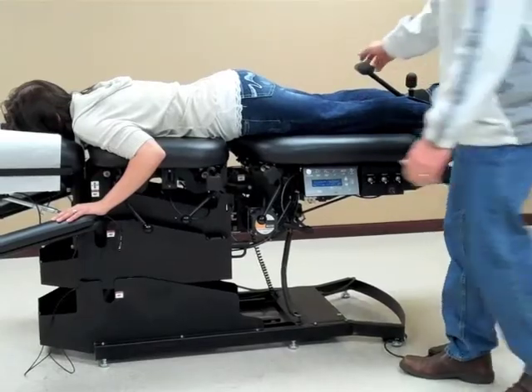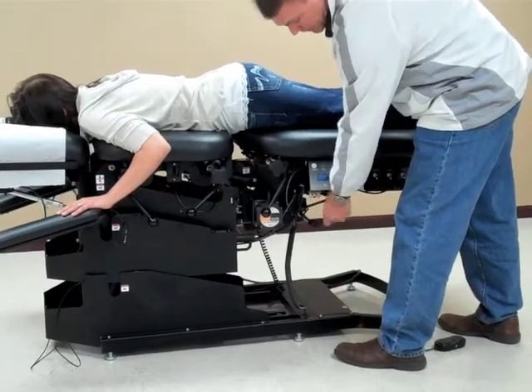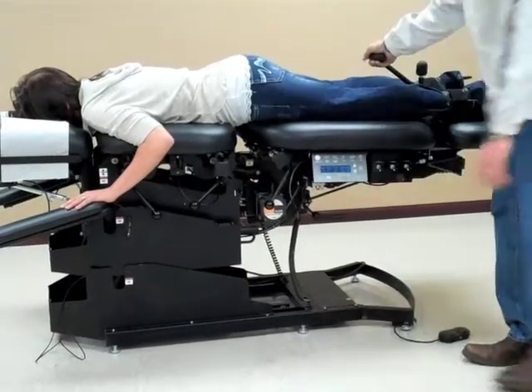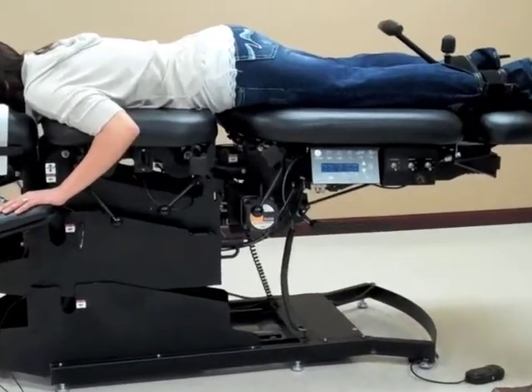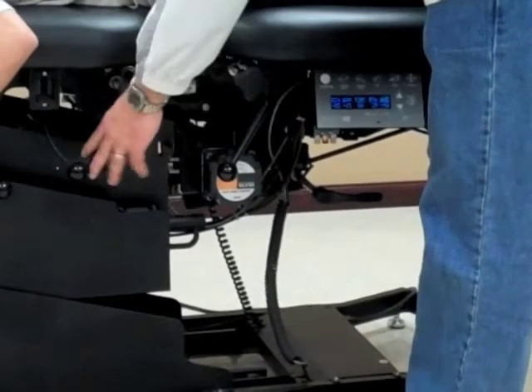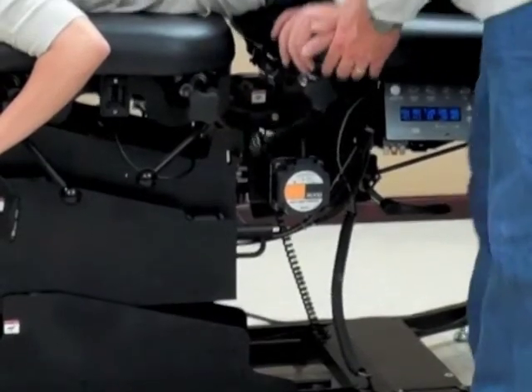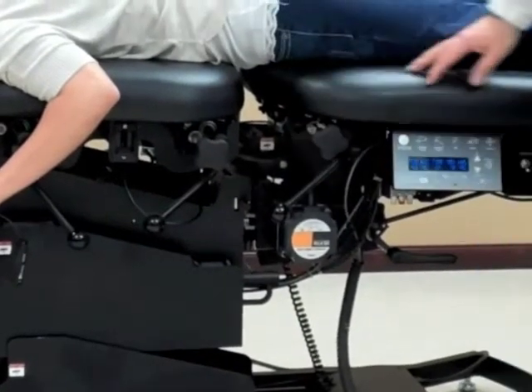I'm going to bring that back. To disengage the table, I'm going to change the locking handle to the back end of the table. If I want to do anything with the drop work, I would use it here to work on the drops.